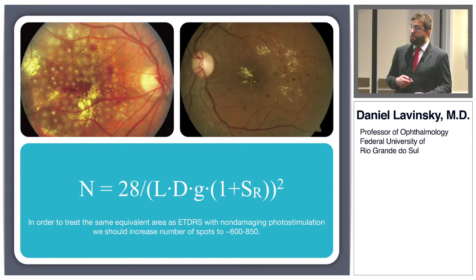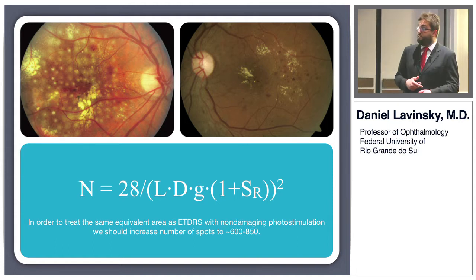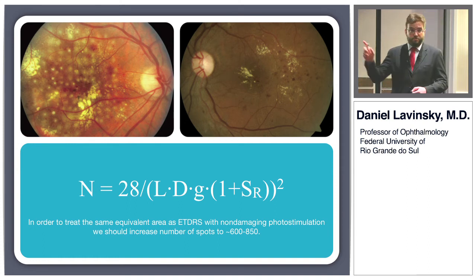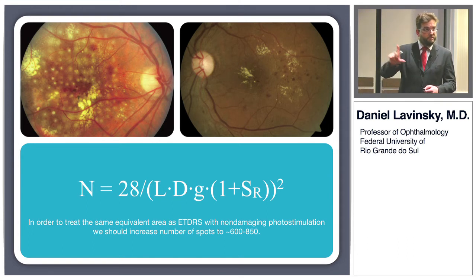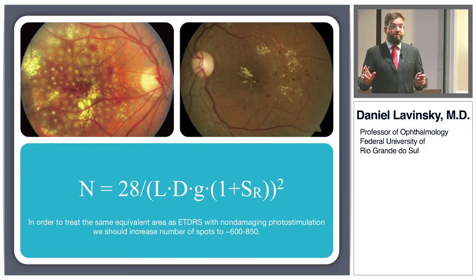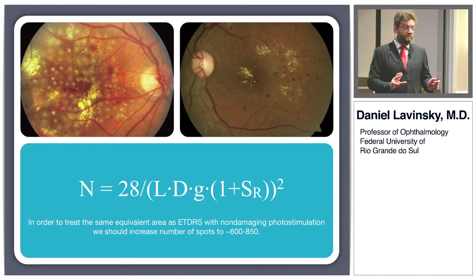So this is about the ETDRS pattern, the ETDRS grid. So these are very intense burns, a lot of burns, very close to the fovea. This is the original ETDRS picture, so it's not from my group. This is the original from the paper. And this is how you should be treating if you say you are treating like ETDRS. No one treats like ETDRS anymore.